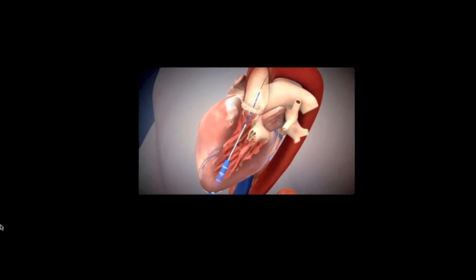And the catheters are directly placed into the heart and across the valve with the same concept of using a balloon valvuloplasty to give a little bit more working room. And the valve follows shortly thereafter, going on top of the native valve, essentially making a functional replacement of the aortic valve.